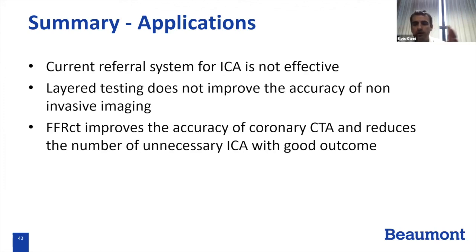So let's say your BMI is like 37 and we gave you 100, and we need to repeat it the second time around, it's probably still going to be 100. For our TAVRs, we use 60, a little bit less, because these patients are older. A lot of them have kidney disease. And even though we try to read the coronaries on all of our TAVRs, that's not a requirement. It's not a must. For the most part, we just need to be able to look at the annulus, the aortic valve, and the bigger structures, so you can get away with a little bit less contrast.